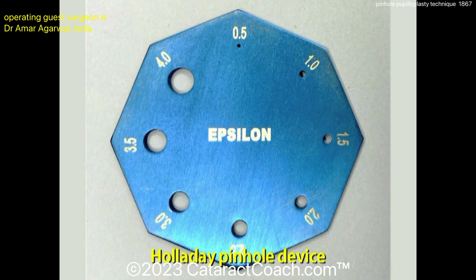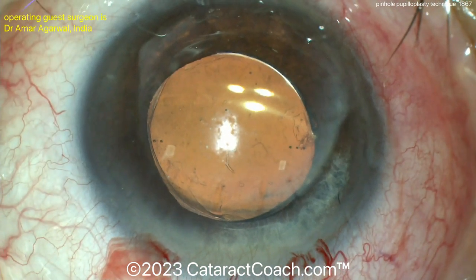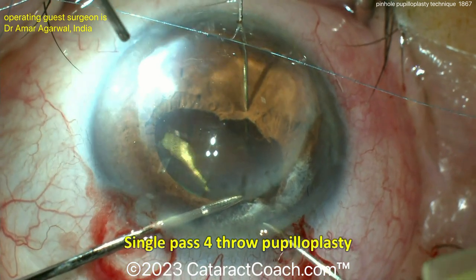The patient is already pseudophakic. There's the pinhole device, which is used preoperatively to determine which pinhole size is preferred for the patient. The patient can look through it in the clinic and decide the correct size, such as one and a half or two millimeters.